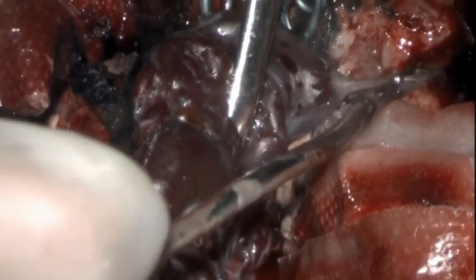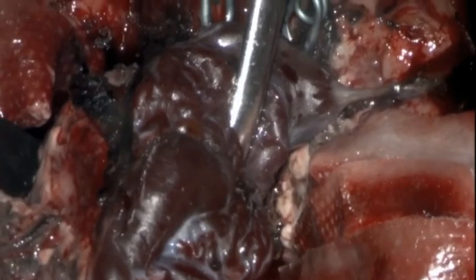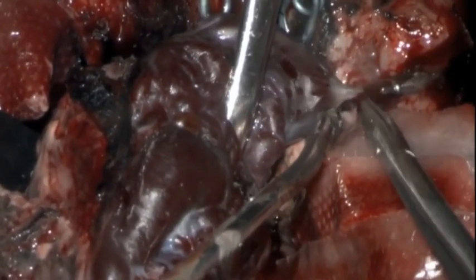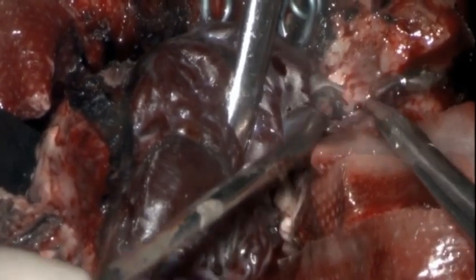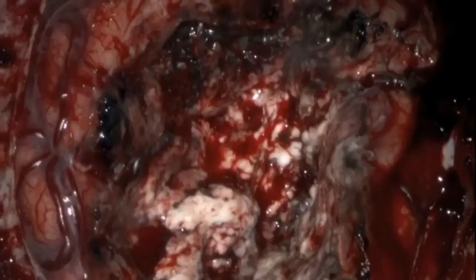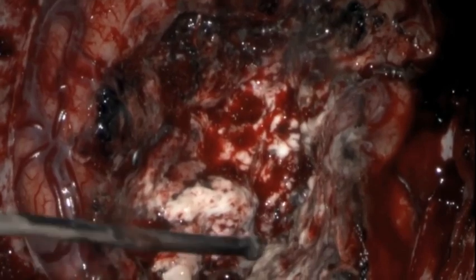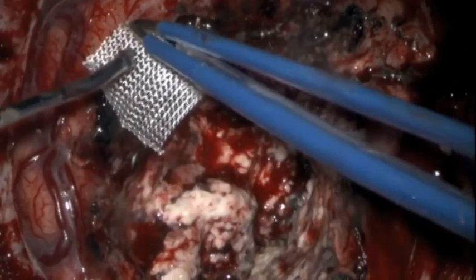Once the AVM is removed, hemostasis is essential at the end of the case. Post-operatively, strict blood pressure control is important. Raising the blood pressure by 15 mm of mercury and inspecting the bed for surgical bleeding may help confirm resection of the AVM. Intraoperative angiograms are also helpful to confirm that there is no residual nidus in questionable cases.